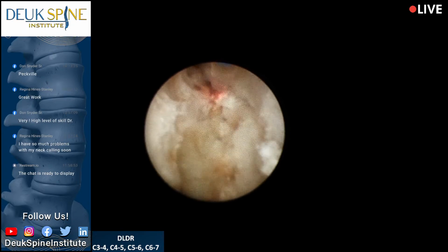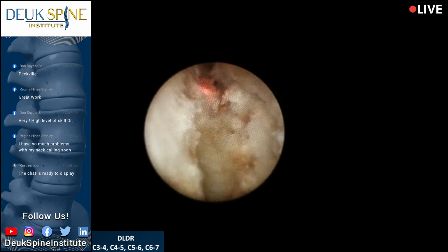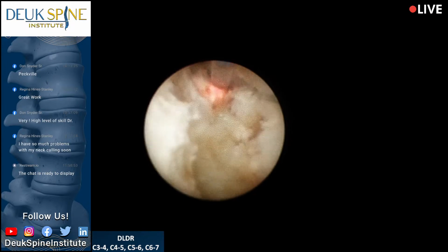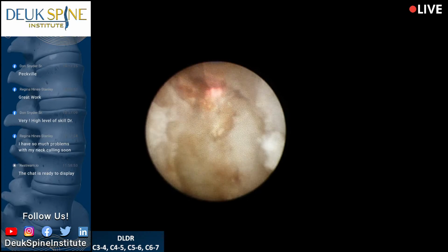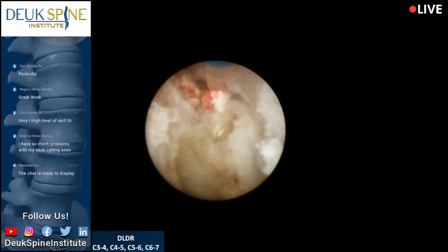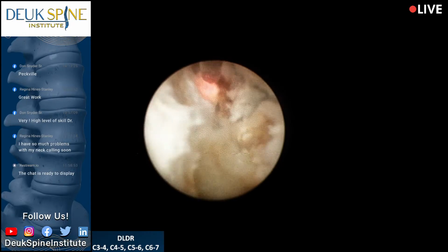Everything is on my side of the PLL. So this is good for me because it means I don't have to go near the spinal cord. I can just decompress below the PLL. See that bone spur just lifting right out? Oh, it's just a rock sitting right on the nerve. Just rolling out of there. Pretty cool, huh?